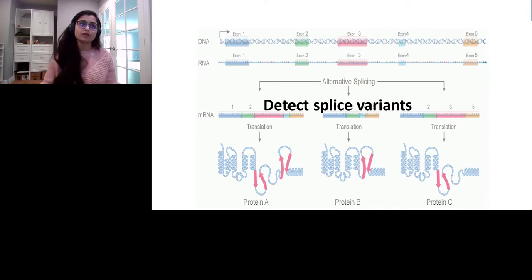If you can see in the panel, on the left-hand side, you have the HER2 IHC, which is not able to differentiate between the wild-type and the delta 16 variant, whereas the RNAscope assay was able to differentiate between the delta 16 splice variant and the wild-type. As a result, they were able to stratify patients based on the RNAscope, the BaseScope signal from this analysis.